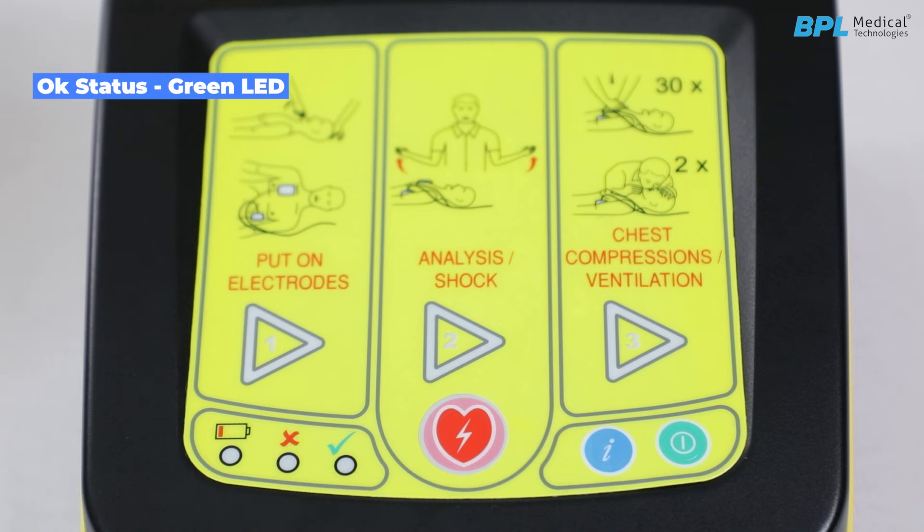OK status or green LED: self-tests are carried out at regular intervals to evaluate the condition of the device. If the self-test completes successfully, a green LED on the front panel indicates that the device is OK. Malfunction status or red LED: if any of the self-tests fail, the device will not be ready for use, indicated by the red LED on the front panel.